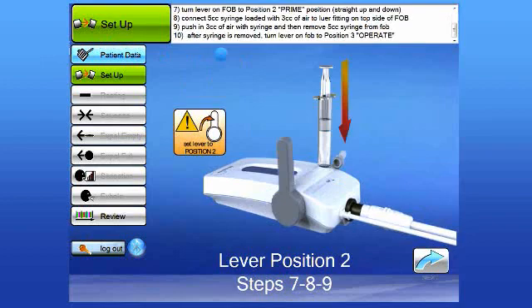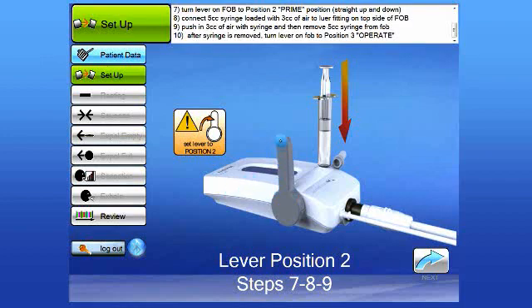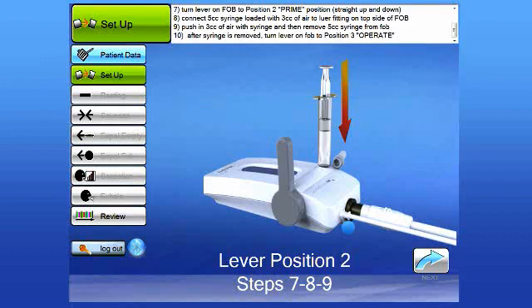As you follow the instructions at the top of the screen, you will see that it says to turn the lever on the FOB to position two. There is a gray lever on the side of the FOB. During setup and use, this lever will have three positions. Position one is in the down position. Position two, as shown in this screen, is in the up position. And position three is forward, facing the catheter position.